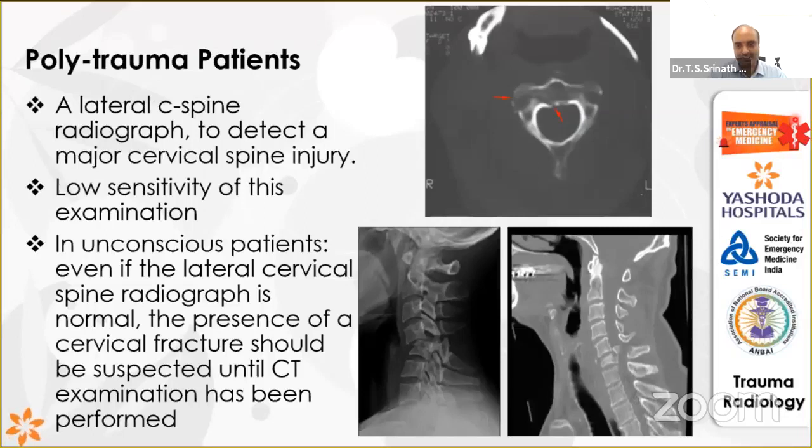The first and foremost important thing is you're looking for free fluid in the abdomen. Not only that, when you do the e-FAST, you're also looking at the contractility of the heart, and whether there is a pericardial effusion or a pericardial tamponade. And you are also looking at whether the patient has a pneumothorax, a hemothorax or hemopneumothorax, or even sometimes you can see fractures in the ribs.